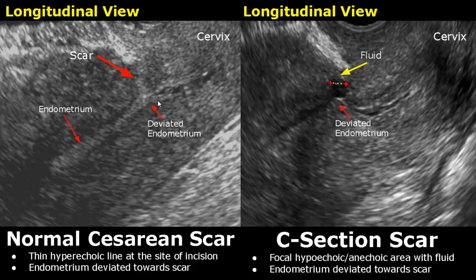On the right side is another image of a C-section scar. There is a focal hypoechoic or anechoic area with some fluid, and the deviation of endometrium is greater here. These are the appearances of a caesarean scar.